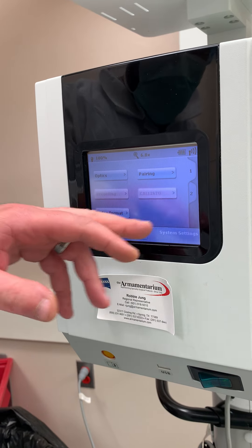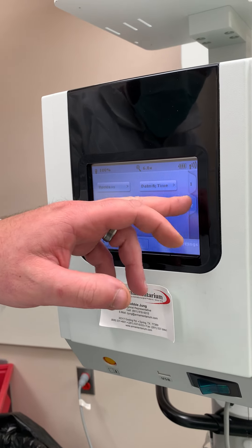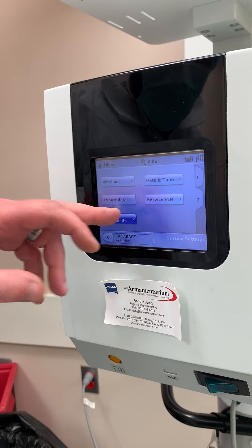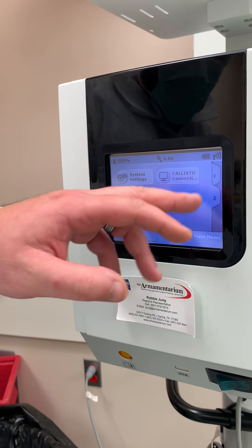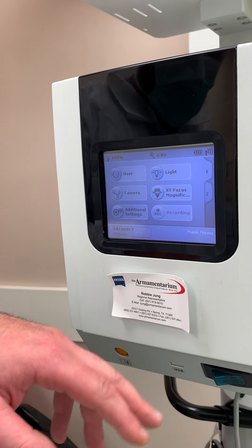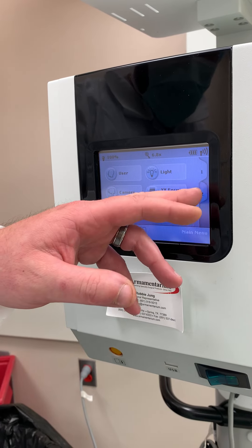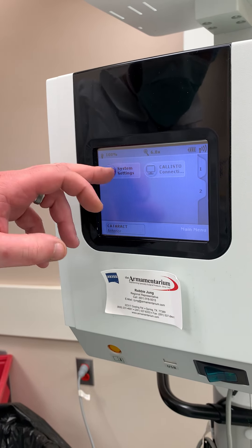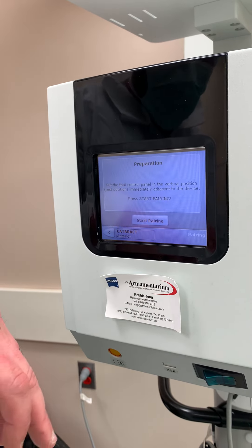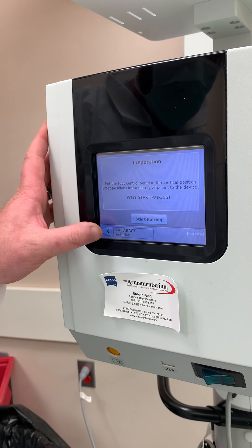You can also check it in system settings, though it's just easier to do it the other way. For lamp service life, same thing. If your foot pedal ever comes disconnected and you need to reconnect it, go to system settings and pairing. Once you start the pairing, it'll give you the directions on what to do.